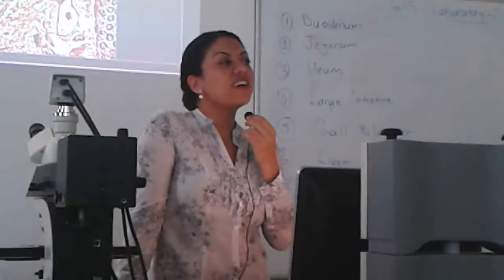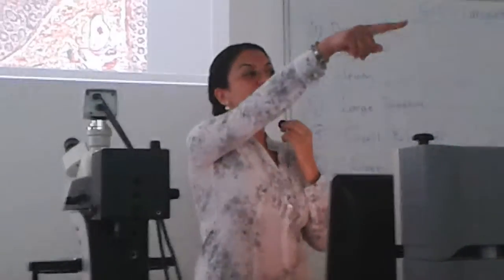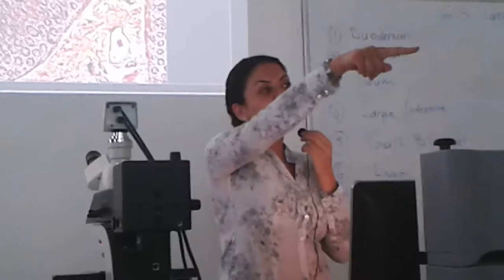First layer. Yes, mucosa. Second layer. Beneath the mucosa, what do we have?